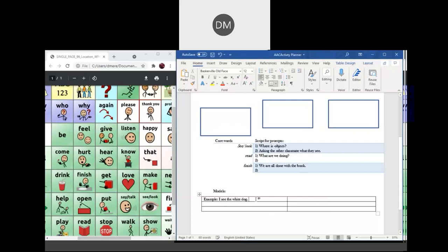Then we can have press C. So even have a direction that not only is whoever is providing this activity giving that verbal model in a full, easy to understand sentence, but also giving the direction to press the button that corresponds with their verbal model.